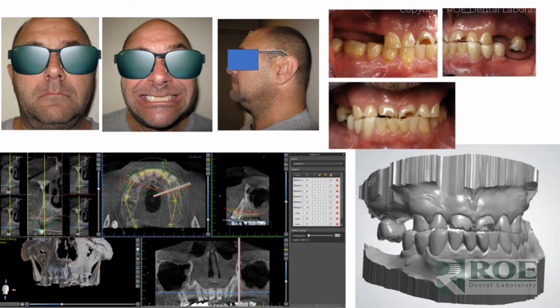We ask doctors to go through the case, make sure everything looks correct, make sure the guided kit fits the osteotomy guide, make sure the pins are tried in and that the fixation base is assembled to the bone model, so just to get an understanding of exactly how much bone reduction and kind of set the tone for the day of surgery.